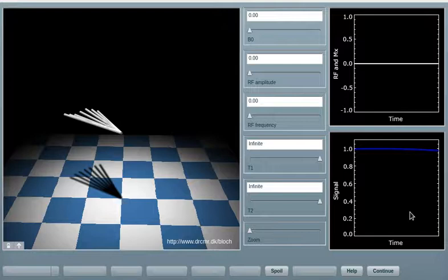Now, sometimes you don't want to reverse T2 star. Sometimes T2 star is what you're interested in, and functional MRI actually is interested in this T2 star because it takes advantage of the fact that deoxyhemoglobin causes inhomogeneities in certain areas of the brain, and it's by taking advantage of these inhomogeneities that are caused by changes in blood flow that we get our signal, our functional, our BOLD, blood oxygen level dependent signal. So that was T2 star.